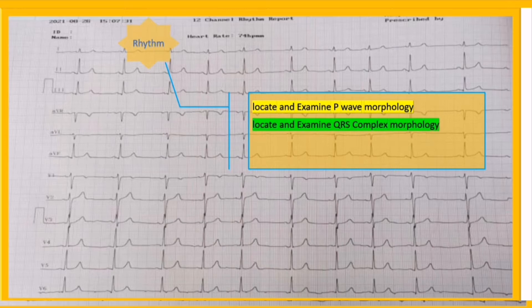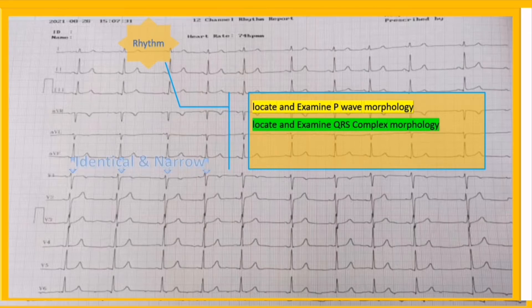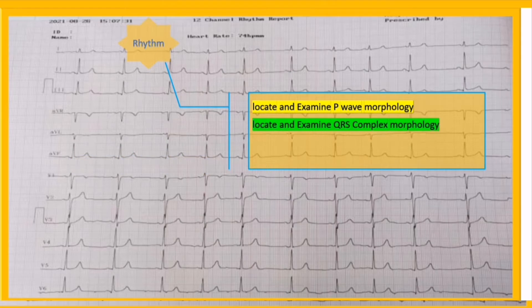In rhythm examination, it's not necessary to examine QRS morphology in detail. At this level, our main questions are: whether the QRS complexes are morphologically identical or not, and whether the complexes are narrow or wide. Here, the complexes are identical and narrow.